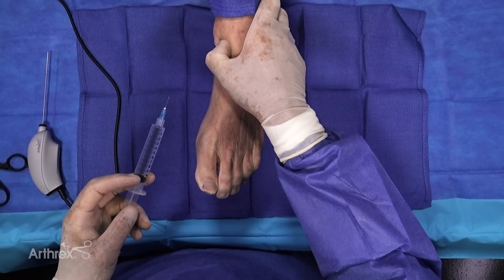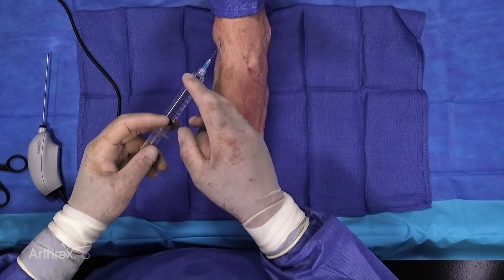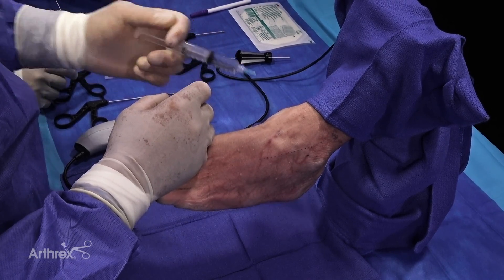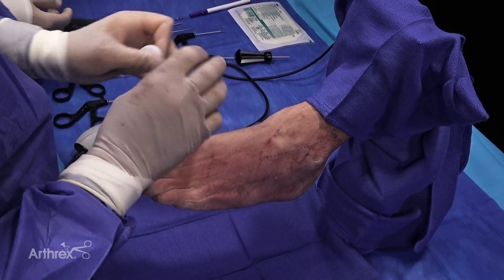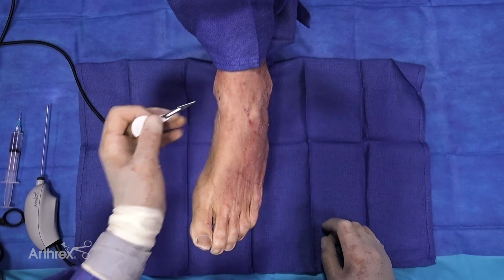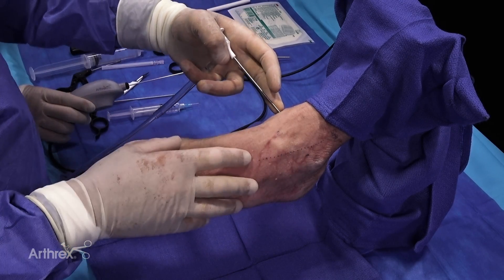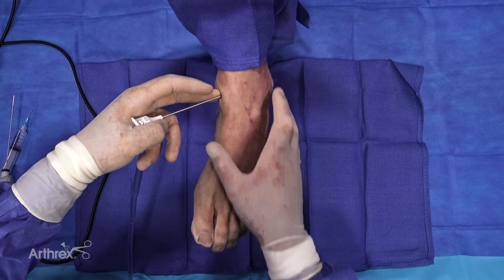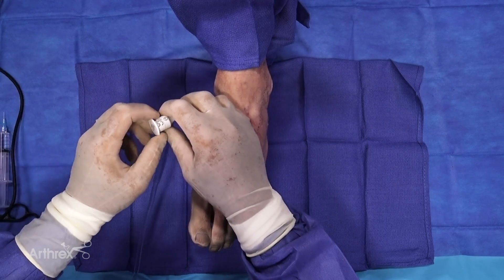We have these pre-marked out portals here — these are standard arthroscopy portals. The first thing we do is create a little bleb in that area, and then we advance that into the joint itself. Once we've done that, we move on to an 11 blade and create a very small nick in the skin. The advantage of the small nick is it only has to be the diameter of the scope itself, so you don't need sutures at the end. Then we just advance that into the joint, and once we go through the capsule, there's a defined pop as it goes through.